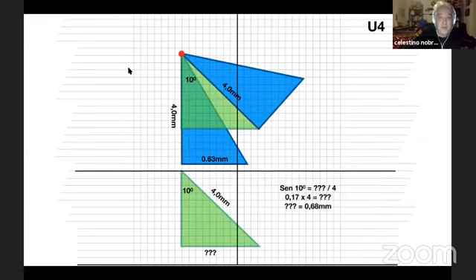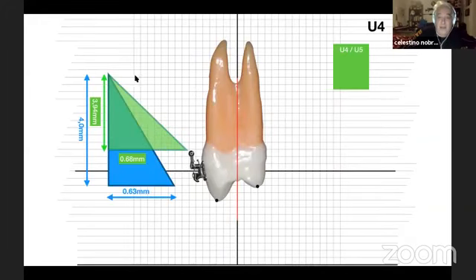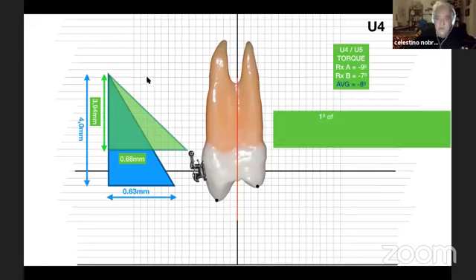What's the difference between those? I did the calculation for all of the brackets. The answer is pretty simple. Let me tell you the truth, right? Let's suppose that I have a lower incisor. What's the difference, clinically speaking, between 0 and -1? Clinically speaking, nothing. From 0 to -1 is nothing.